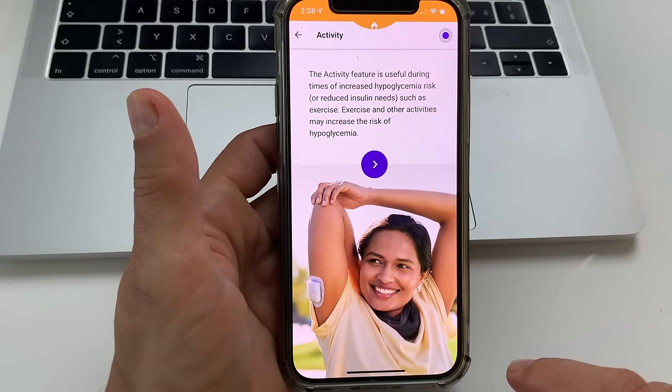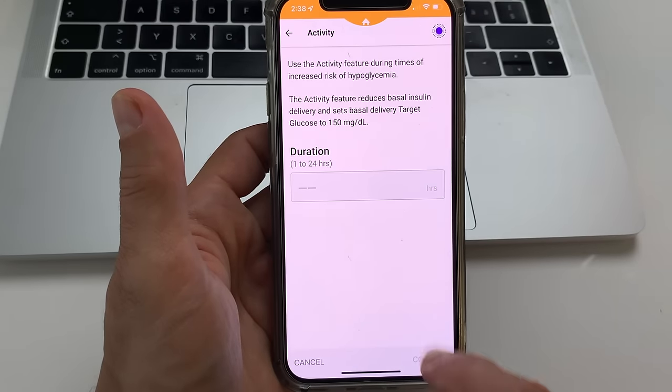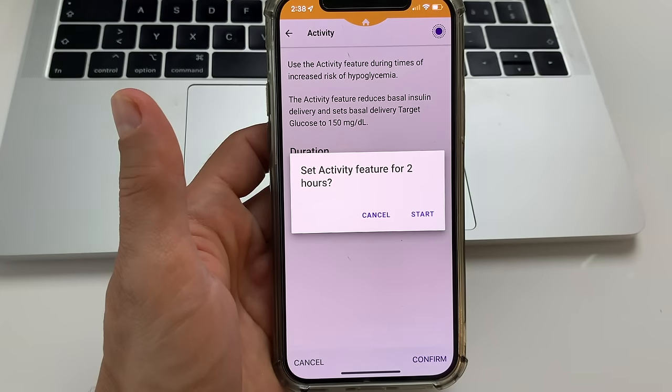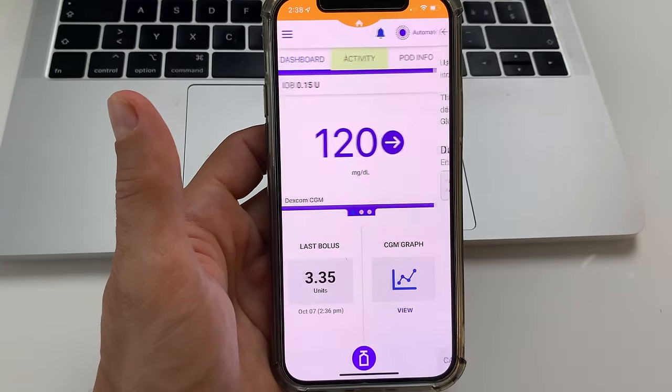The smart adjust algorithm increases insulin delivery when it sees that your predicted blood glucose is too high, and decreases or completely stops insulin delivery when it sees that your predicted blood glucose is too low. The system also has an activity feature which you can activate during times when you exercise, and it automatically reduces basal insulin delivery so that your blood sugar doesn't drop too low. When the activity feature is on, your target glucose is automatically set at 150 milligrams per deciliter.